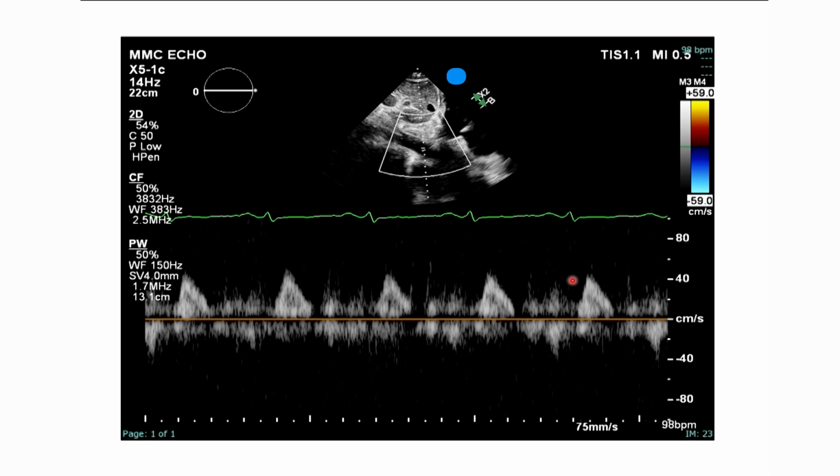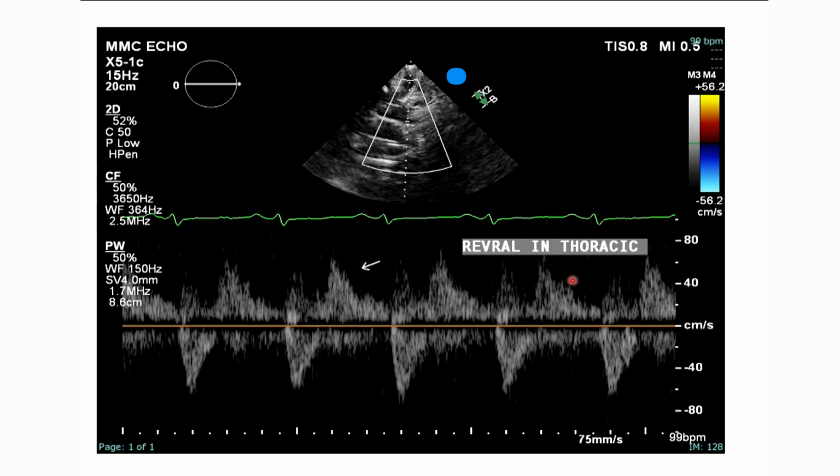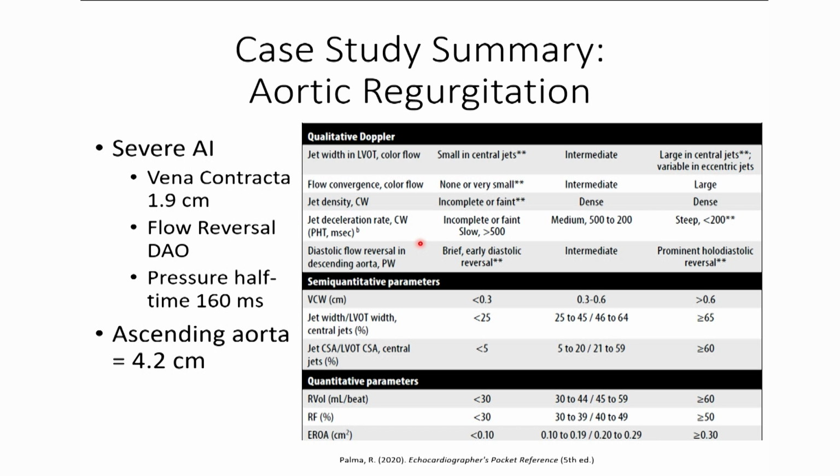We're not always looking at the aorta. Here it doesn't look like we really see much reversal, but they did catch in the suprasternal notch in the descending aorta, they did catch some flow reversal here. So I'd say definitely, you look at the vena contracta was almost 2 centimeters.